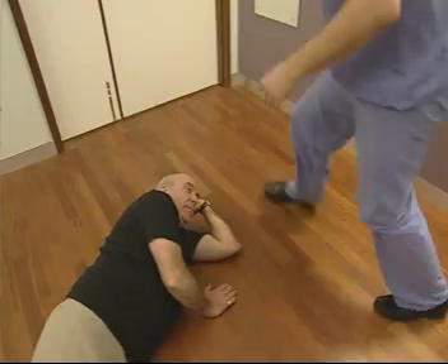Following a careful risk assessment to establish that the patient is not hurt but unable to get up, we will see a full back sling being used for a floor to bed transfer.